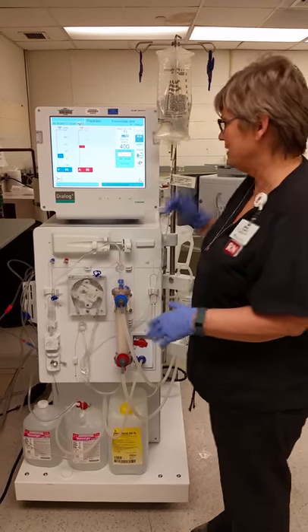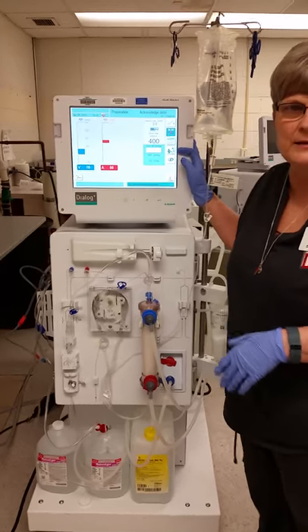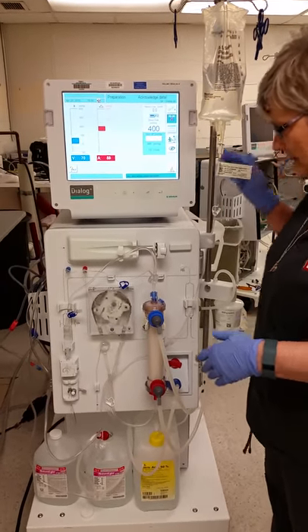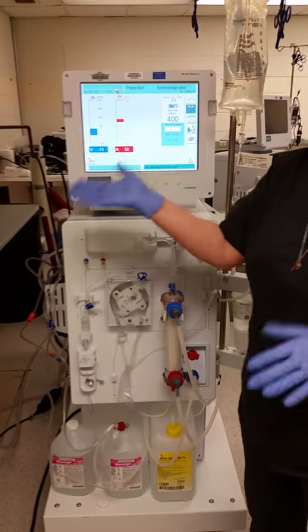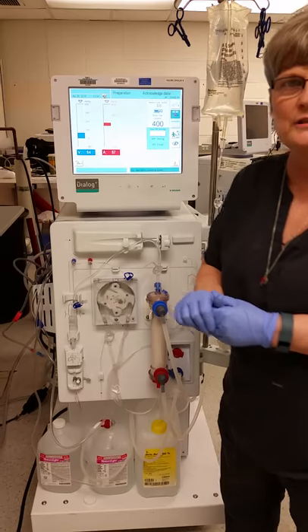When you're getting ready to start your patient, you need to have your machine prepped and ready. You should make sure that you have a green man, meaning that it passed all its tests. Once you have that, you have your initial vitals and things on your patient, and you would get your access prepped for your patient.